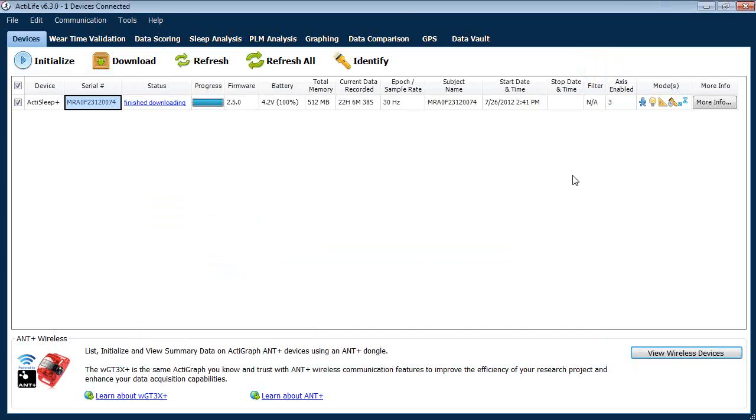So we have some upcoming features I want to go ahead and briefly go over. One of the upcoming features is called remote monitoring. Basically, we're going to be using smartphones for bidirectional communications between the patient and the doctor or clinician. ActiGraph's web services can store communication transcripts and can be used for data analysis even before the study ends. Raw data can be stored and analyzed within the web services solution, so this becomes a really good asset to your tools when working with patients in our devices.